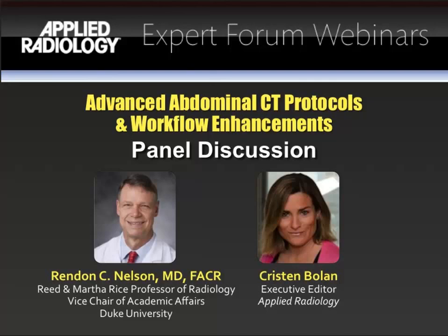Just a couple more questions. What is your stance on IV hydration for patients with poor renal function? So I think IV hydration, there's not a lot of data on it, but I think it is effective. I think it's easy to do. If you go to the literature, there's lots of different protocols for doing it. Some people say giving up to a liter. I think generally what's thought is that it's probably worthwhile to hydrate the patient before the scan as well as after. If you have the option of doing it only once, I would do it after rather than before. And you might actually give them a liter over an hour or so. That's a conservative way of giving it. There's not a lot of data to support that particular protocol, but it is a strategy that many have used, because there's really not a lot of data out there, even though I think it's probably one of the more effective ways to minimize contrast-induced nephropathy.